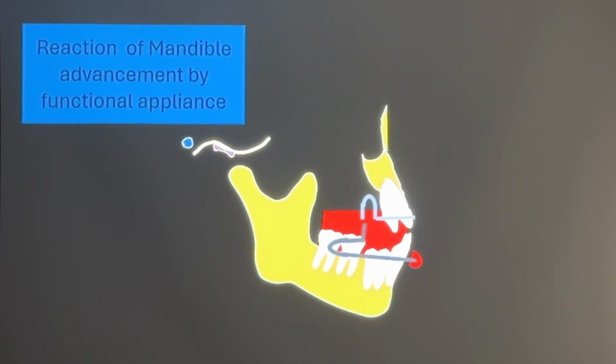But when you remove the functional appliance from the patient's mouth and start to induce the patient to bite by themselves, at that time 1 millimeter of eruption will occur. The overbite will change a little. You can catch it. So please don't make too much thickness, just 1 millimeter.